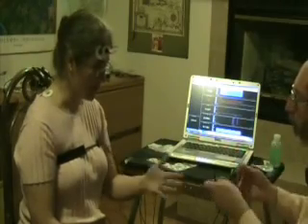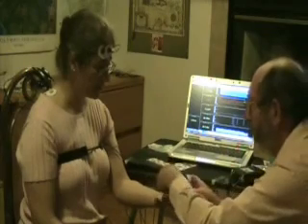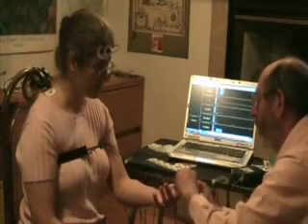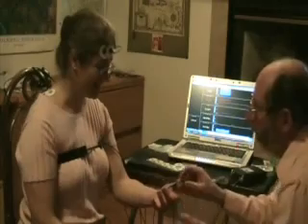I'm going to be putting this on your thumb. Oh, here we go. Your job is going to be to tell me whether your thumb's getting ice cold, because we don't want to cut off the circulation to your thumb.